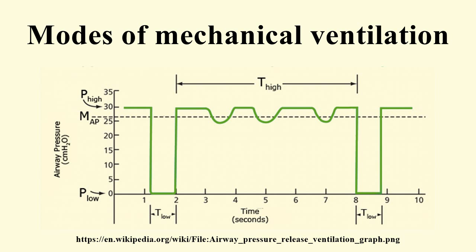The user must then regulate the pressure support level to obtain desired ventilation. Pressure support improves oxygenation, ventilation and decreases work of breathing. Also see adaptive support ventilation.